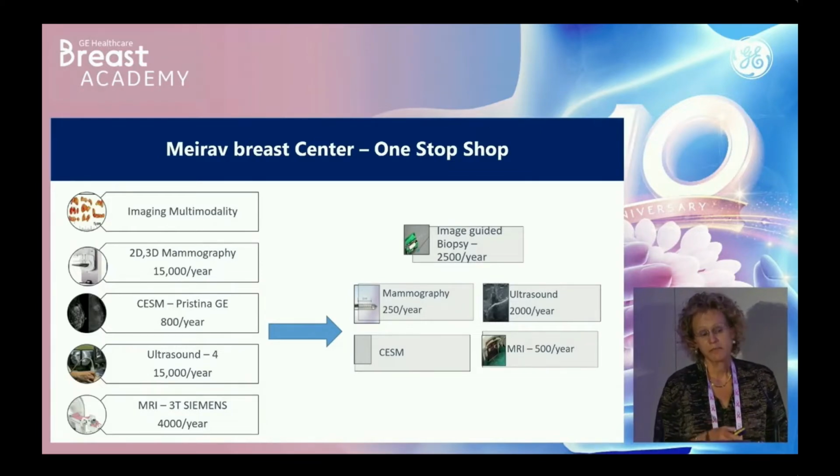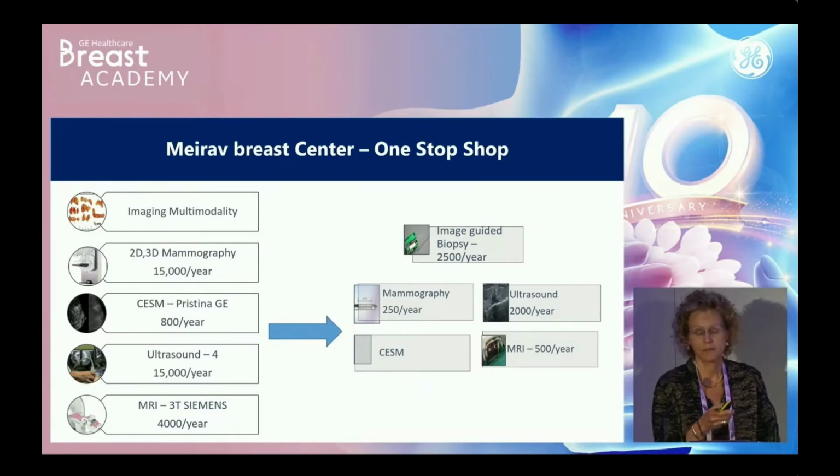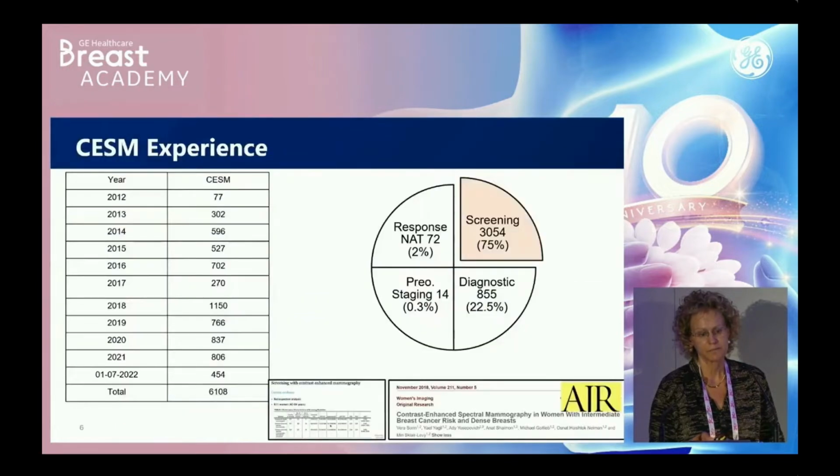It's not the place here, but we are also developing ultra-fast breast MRI, and it's possible to do a kind of full protocol in 5 minutes, but that is not the issue of this session. And of course, we do a large number of image-guided biopsies.